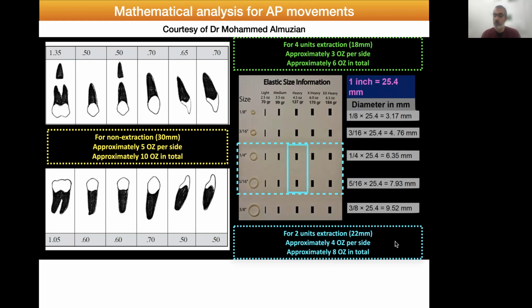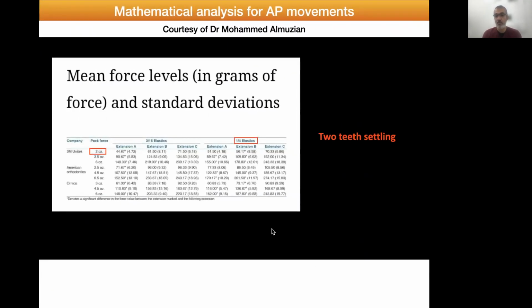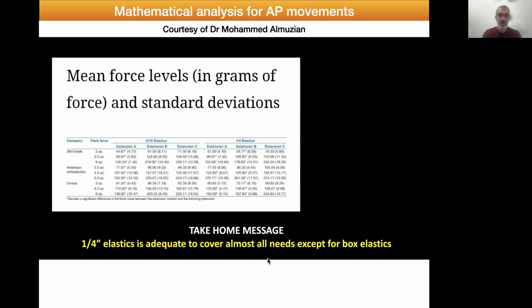Anyway, you might feel confused rather than benefited from this presentation, but I have summarized it for you, and this is based on a study which has been published recently. It showed that the best elastic for settling 2 teeth is 1/4 inch, 2 ounce. The best elastic for intermaxillary extraction cases is 1/4 inch, 3.5, and the best elastic for intermaxillary non-extraction, by intermaxillary I mean class 2 or class 3, is the 6 ounce, and for box settling elastic the best is 2 ounce. In summary, this paper showed that a 1/4 inch elastic is actually adequate for almost all our needs.